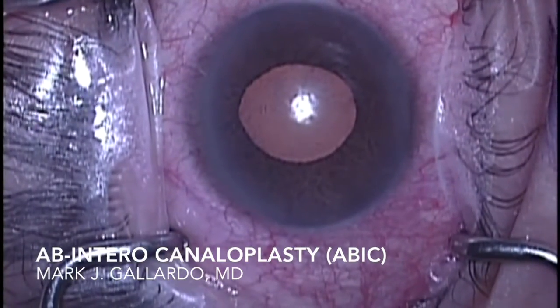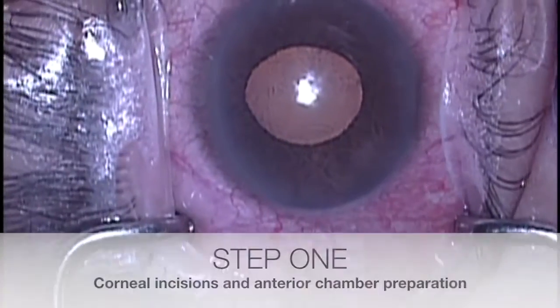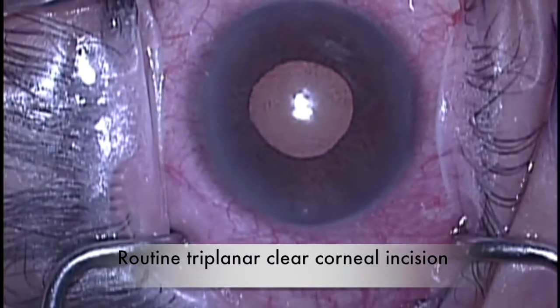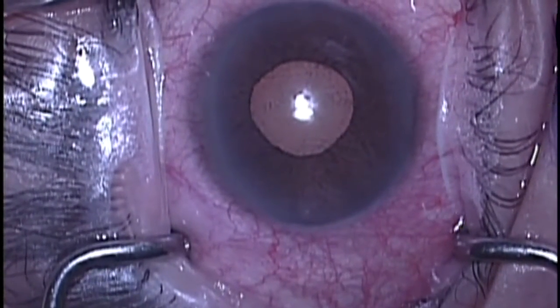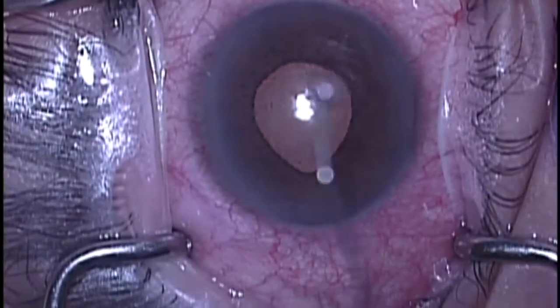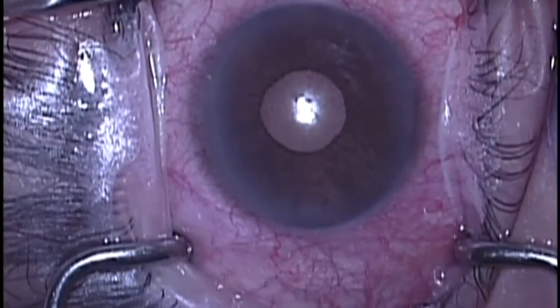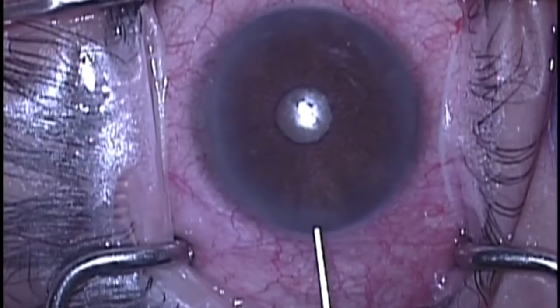Ab-internal canaloplasty, like other microinvasive procedures, is performed through corneal incisions. The primary incision is your typical triplanar temporal corneal wound, followed by a paracentesis 90 degrees away. In this patient, because he is phakic and undergoing a stand-alone procedure, myostat is infused into the anterior chamber to provide pupillary constriction in order to avoid violation of the anterior lens capsule.